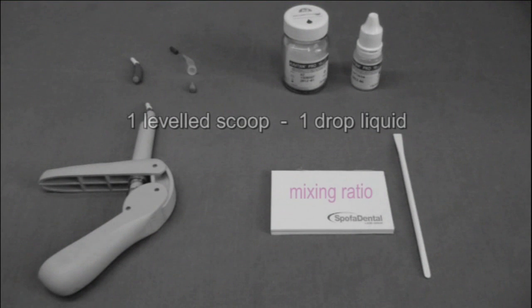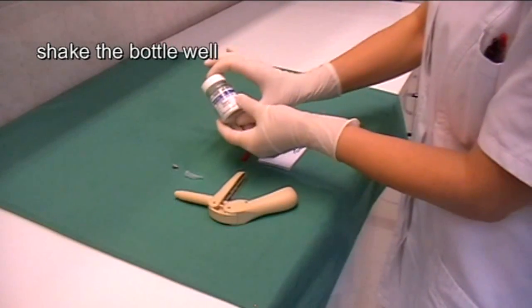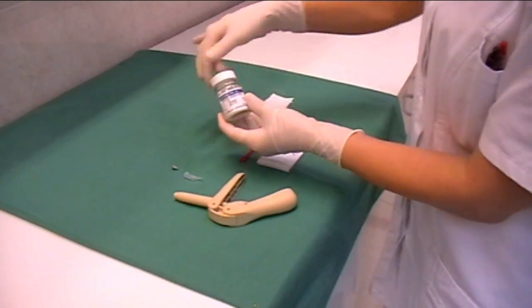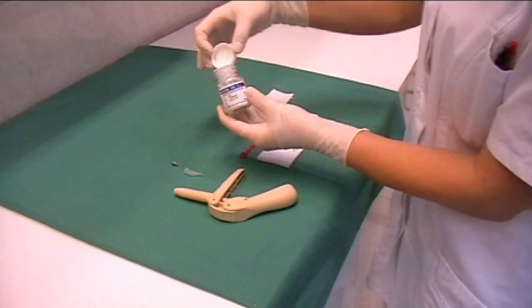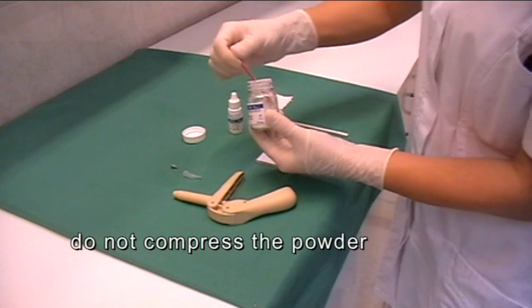Mixing ratio is one leveled scoop to one drop of liquid. Shake the bottle well. Do not compress the powder.